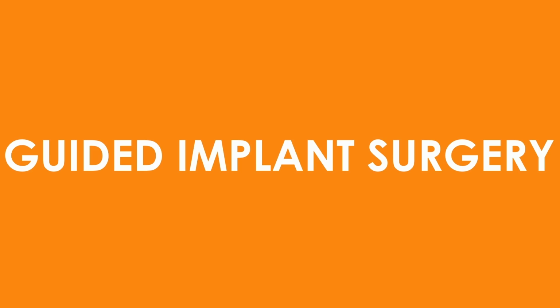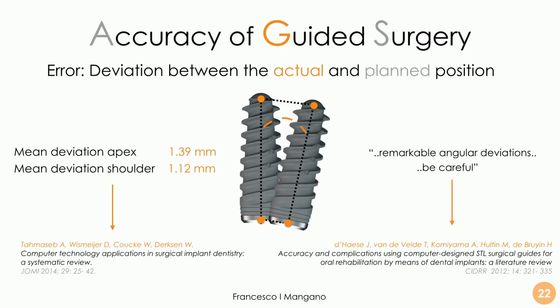When we talk about guided implant surgery, of course we must be very careful because we are going to design, fabricate and use a surgical guide that is created on a set of 3D images, and these three-dimensional images are captured with the intraoral scanner, but also from a CBCT because we need the data of the bone under the tissues.